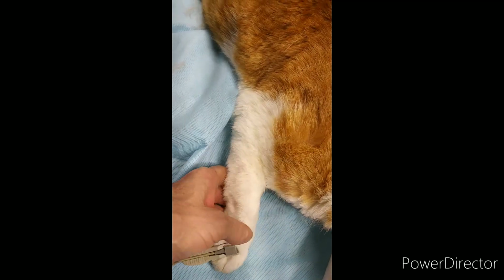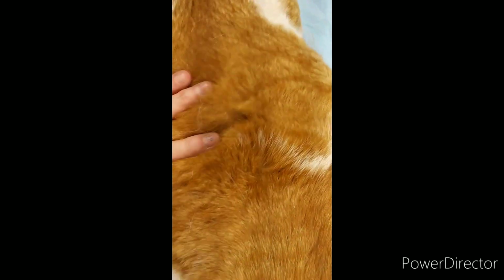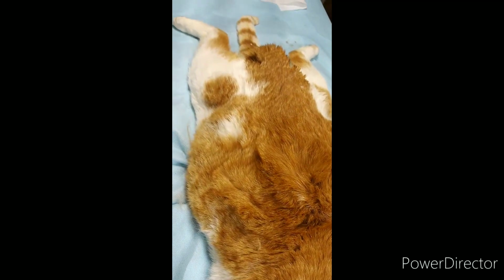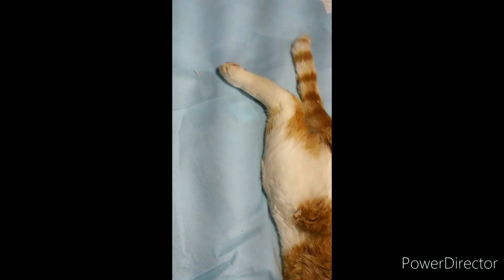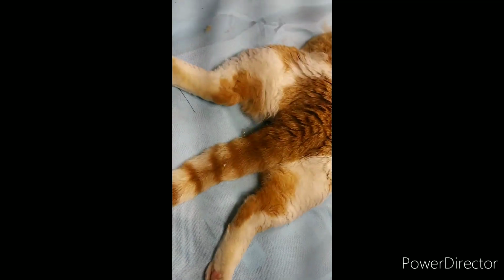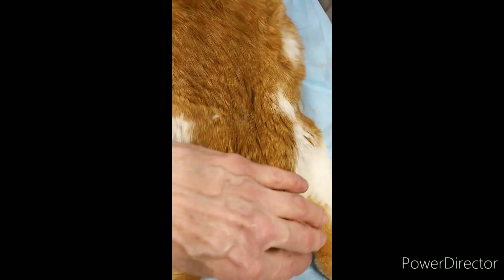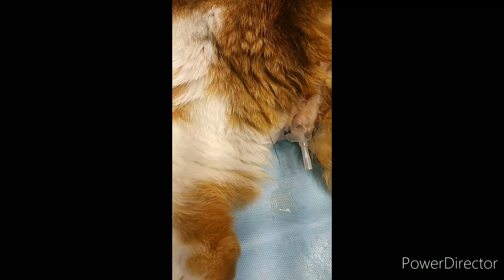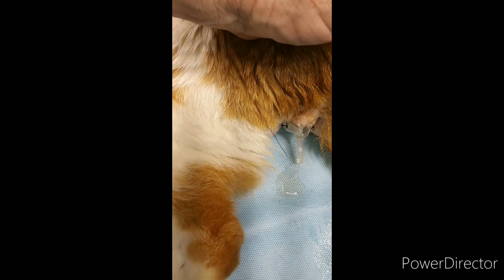I can put a catheter in him if he starts showing signs of uremia. But as of right now, he came in hydrated. He came in eating. So we're going to go with sub-Q fluids until otherwise. And there's his little catheter, and it's just clear as it can be.